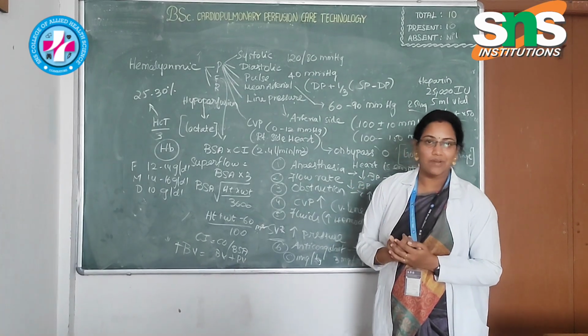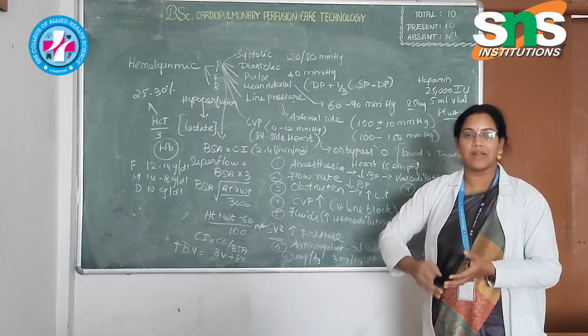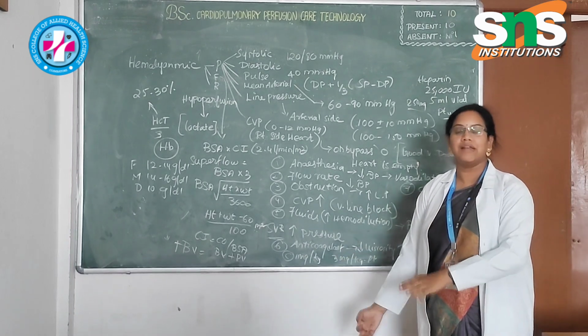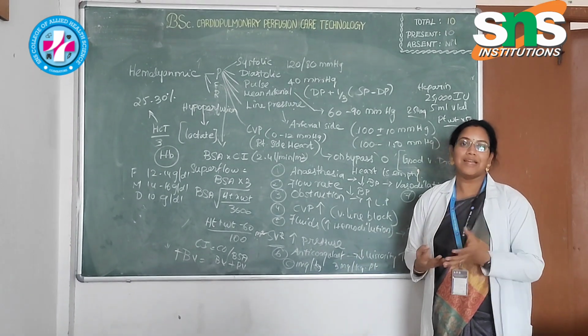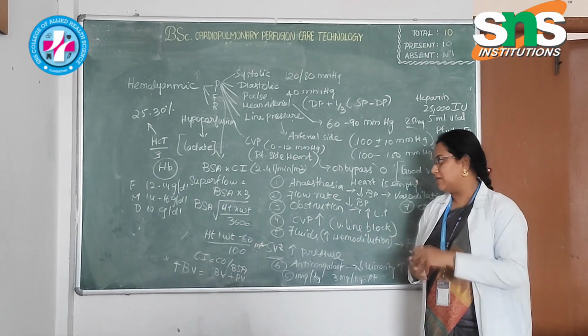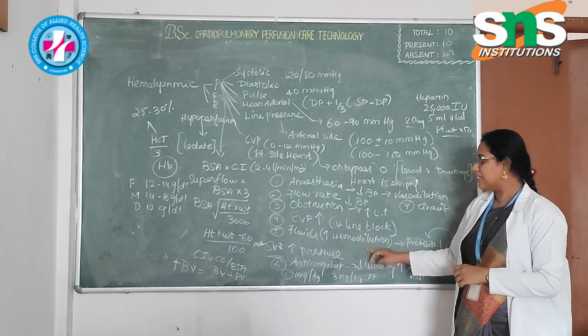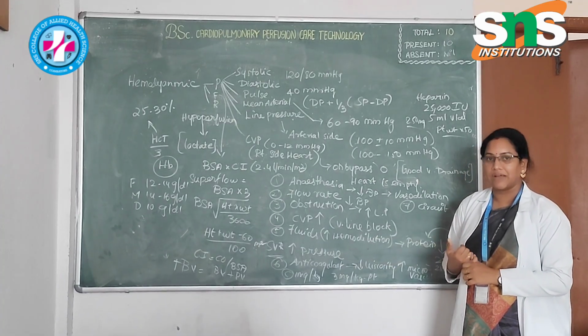That means a proper cannulation, proper selection of cannulas and proper position of the venous cannula, below the patient bed level, is important to attain gravity. Gravity siphonage will give a good venous drainage. Next one is the fluids. Increase in hemodilution is also a major factor.